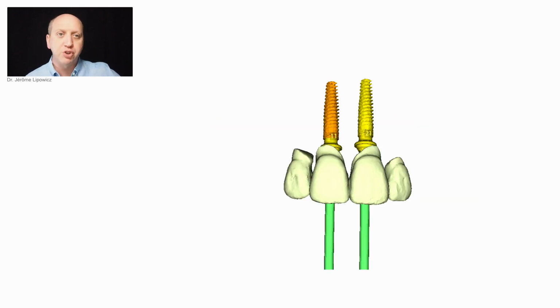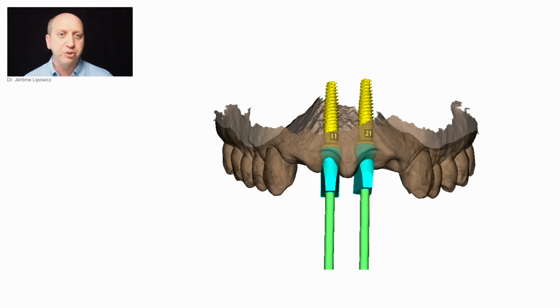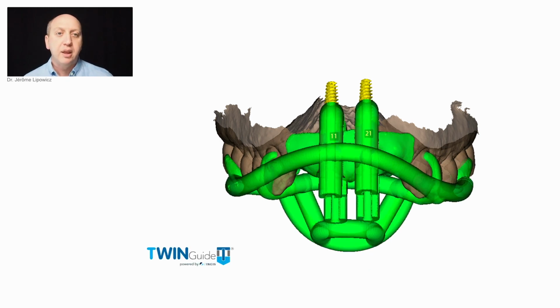The prosthetic option we choose is to have 2 lateral incisors as cantilevers. We planned the multi-unit abutments also virtually and we set them parallels. Then we exported the virtual scan body again and we send them to the lab. And of course, to solve this case with guided surgery, we let the design to twin guide.